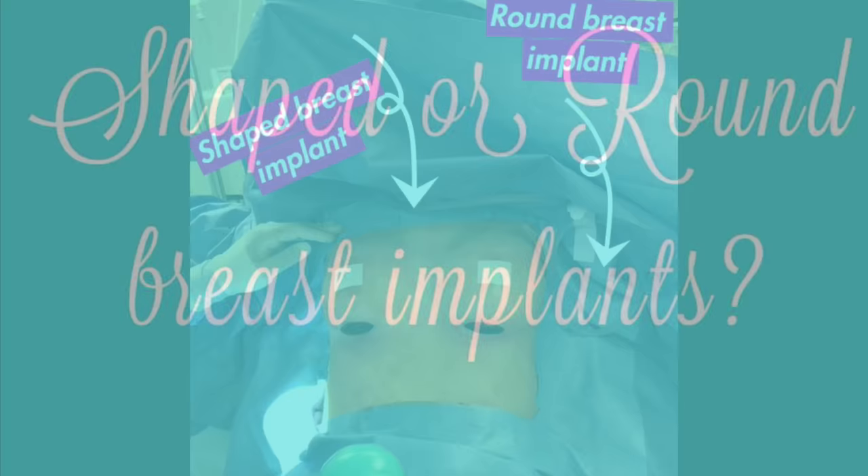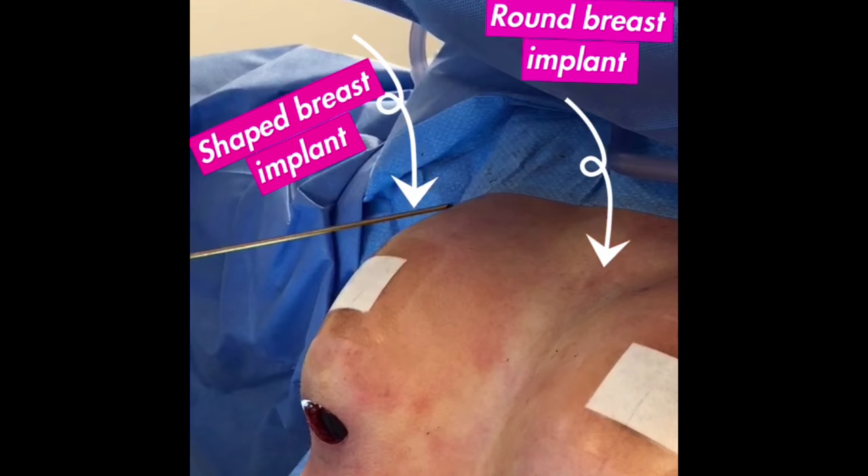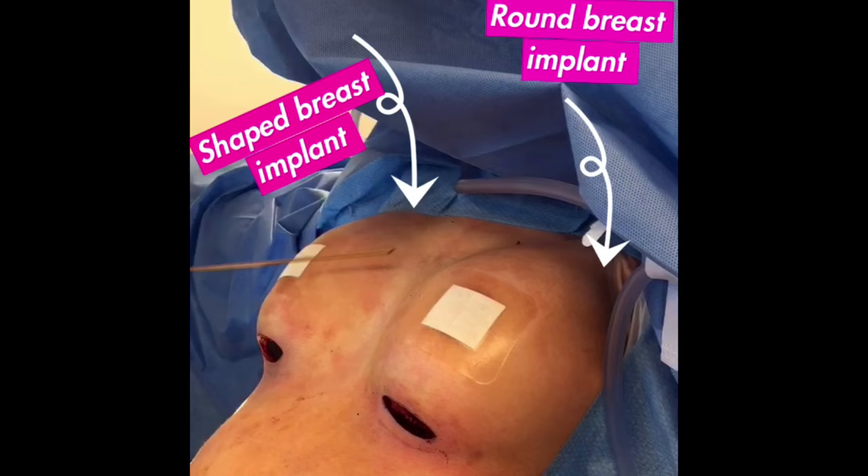I'll take a moment to show you the difference between the teardrop shaped implant and the round sizer. With that teardrop shaped implant, we have a much more natural slope at the top and much more of a breast shape, as opposed to a round ball shape that you see with the sizer.